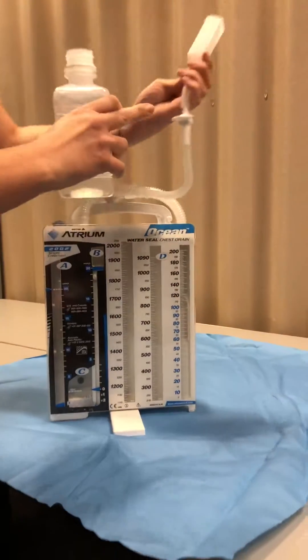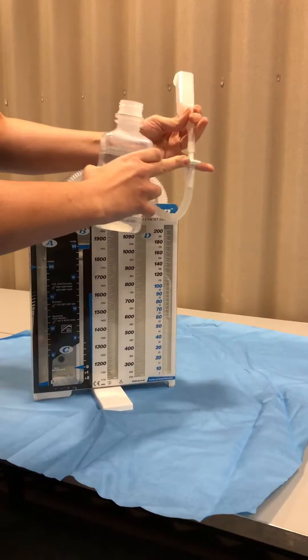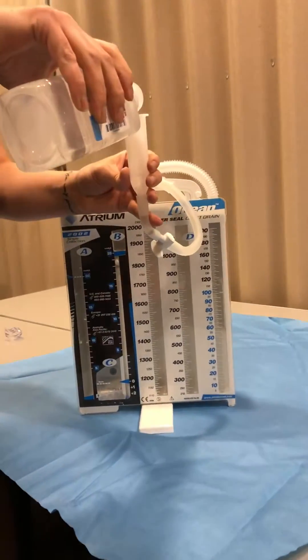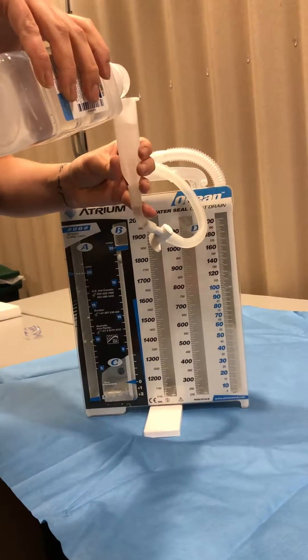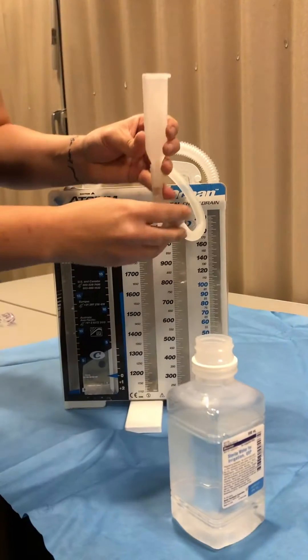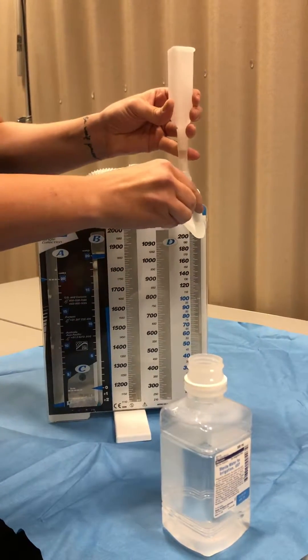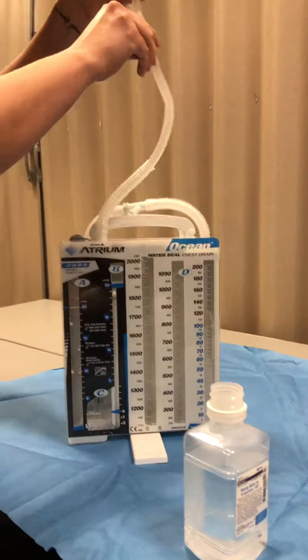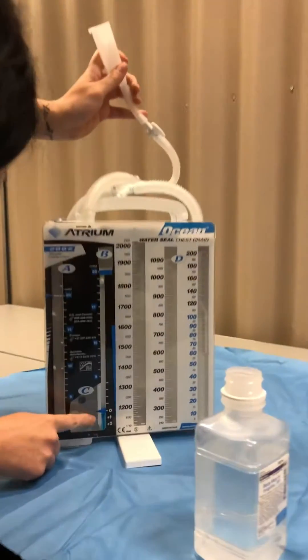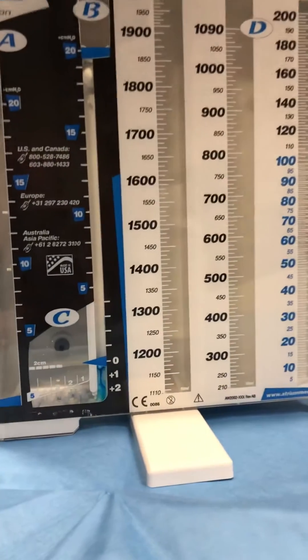So here we are. We have the stopcock this way. Fill it all the way to the top. Now we've got to turn it. All of that went down and it's right there at the two centimeter mark now.